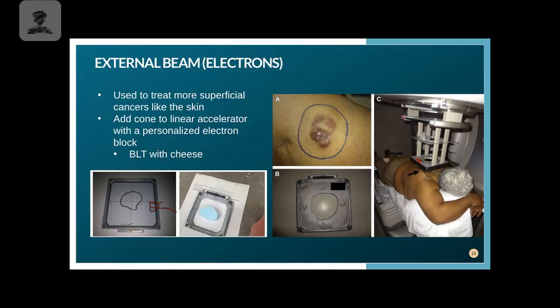So it's like a hot wire. And you are going to guide the styrofoam into the hot wire. It's kind of creative. You've got to have some good dexterity there. And you're going to cut off the outside that you don't need. So when you cut off the outside that's surrounding that traced area, you're going to be left with a couple inches thick of foam that's in the shape of the original tumor.